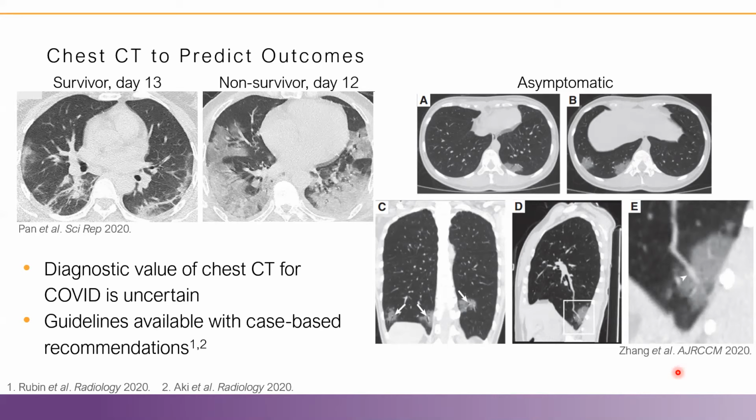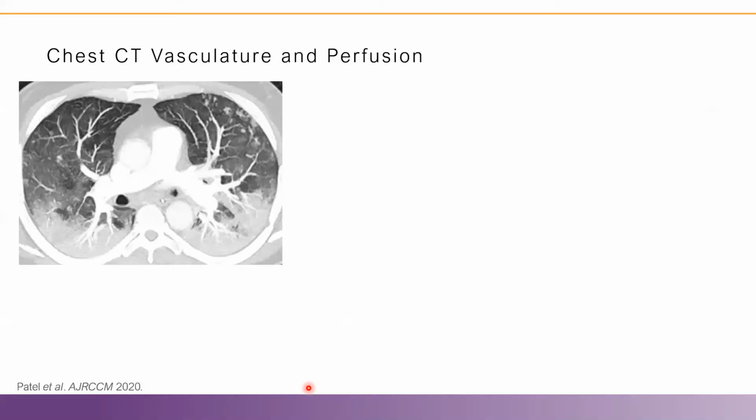So the diagnostic value for chest CT is slightly uncertain right now, but there have been guidelines established and published by the Fleischner Society here, which is an international group of chest radiology, and also by the World Health Organization.